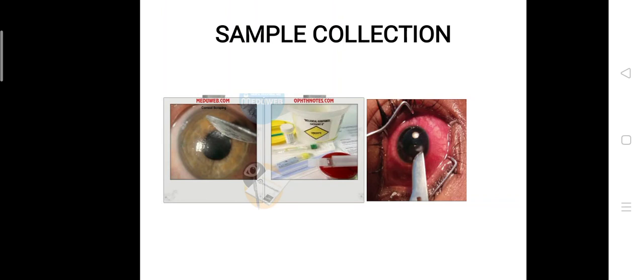The specific pattern on the plates becomes very important if you are also collecting for culture from the eyelids or from the conjunctiva. Now you have to rescrape the ulcer for each different plate of agar using a sterilized tool each time.